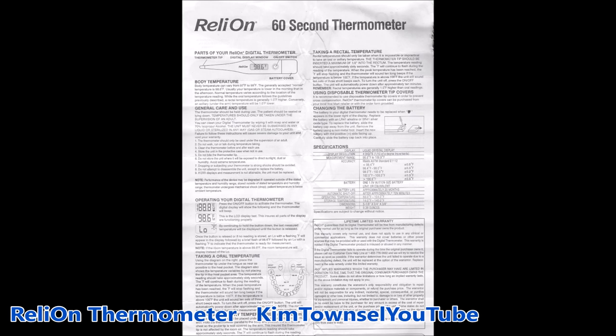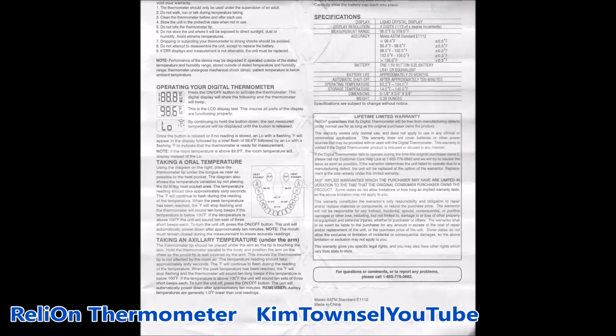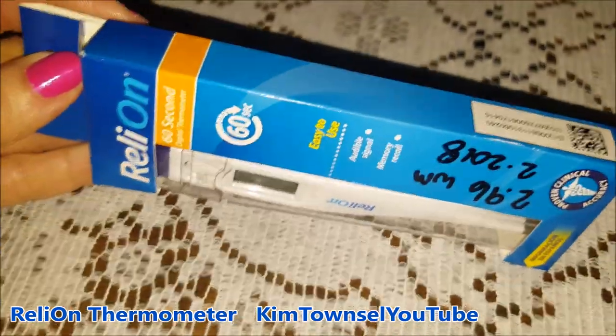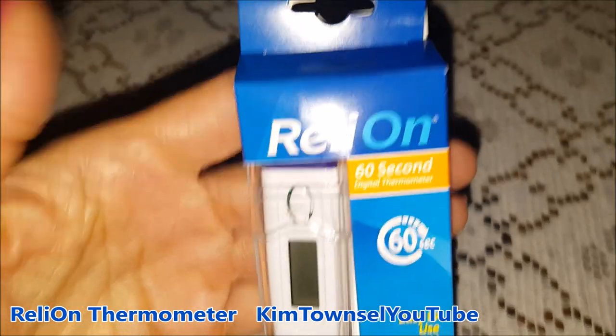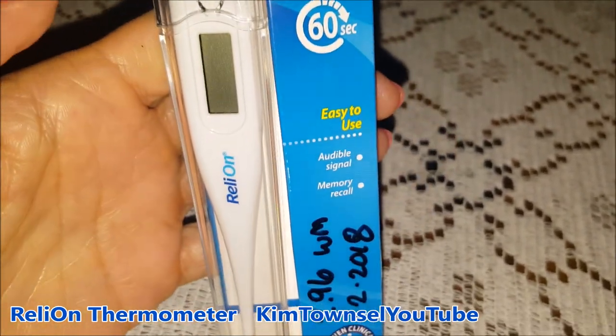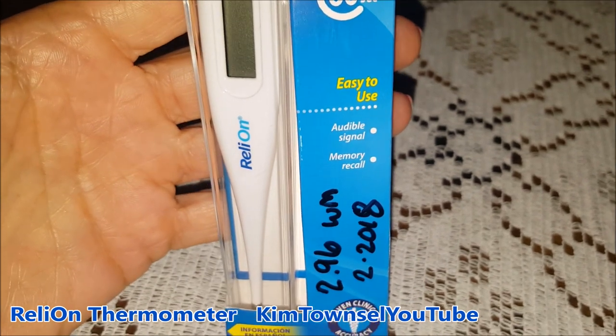The Rely-On thermometer comes with very clear instructions. It shows you exactly how to use the product. The instructions come in English and Spanish. There's a rapid flu season right now in America, so I purchased this thermometer. It was cheap enough from Walmart — $2.96.